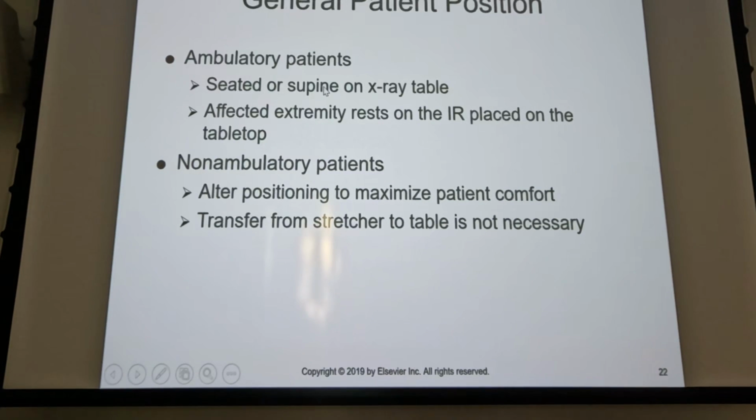So, like I mentioned before, move the patient as little as possible. Most of these things you can do with a patient in a wheelchair. Their feet hurt, right? You might not want to get them up on the table. So consider shooting them on the floor. Well, how do I do that? Well, I'll tell you here in a minute. If you have to get them on the table, certainly get them on the table, but most of these you can do in a wheelchair.